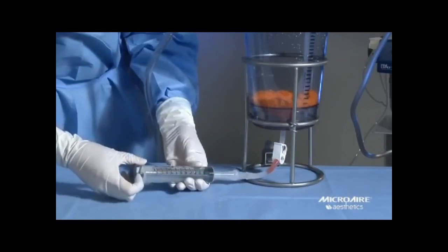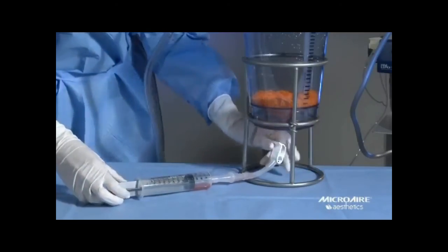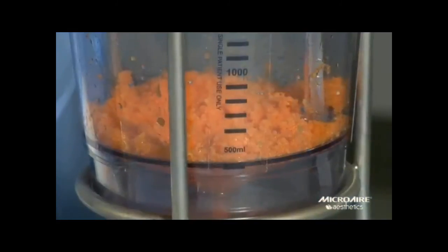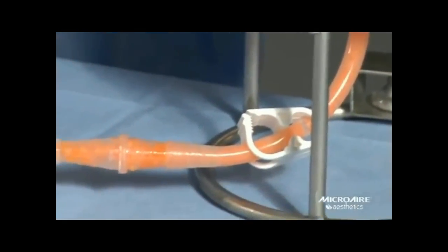Don't forget to close the pinch clamp again before removing the syringe. Reattach the tomy syringe, open the pinch clamp, and draw out the fat.